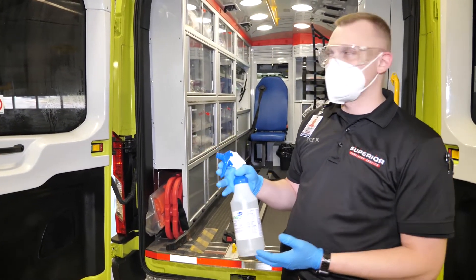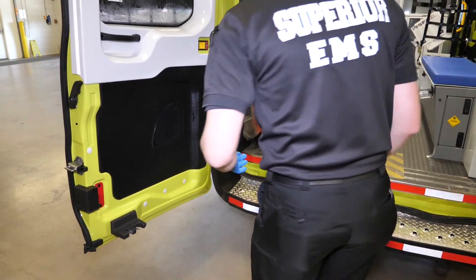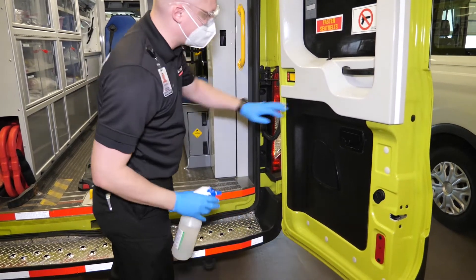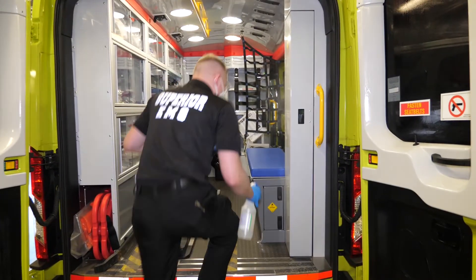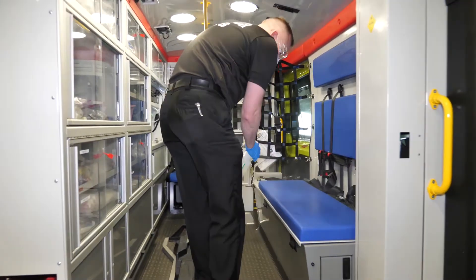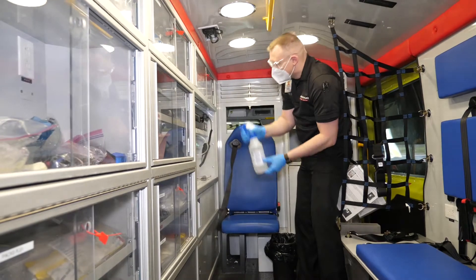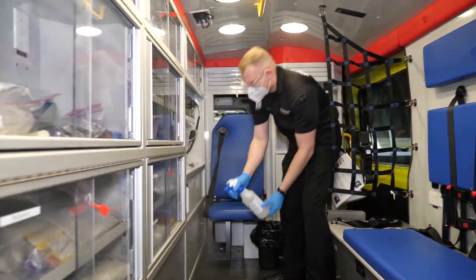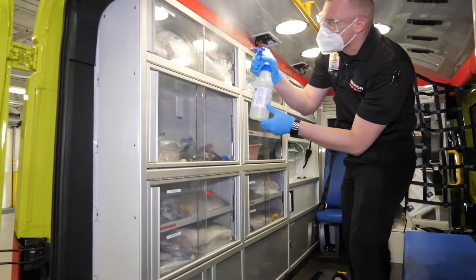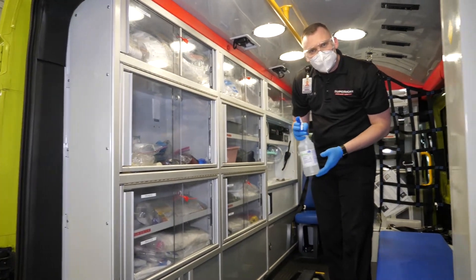Once we're done with the front of the vehicle, we want to move to the back. Same process — we're going to take our brew tab manual sprayer, spray a fine mist over all surfaces, making sure that we get them wet. Contact time with the new solution is one minute to kill COVID-19 and other decontaminants. We're going to move through the vehicle, making sure we continue to spray with our PPE on. Total time for the vehicle for the air exchange process is 30 minutes, and we can do this during that 30-minute period because we're wearing our PPE. Make sure we get the floors and the ceilings.